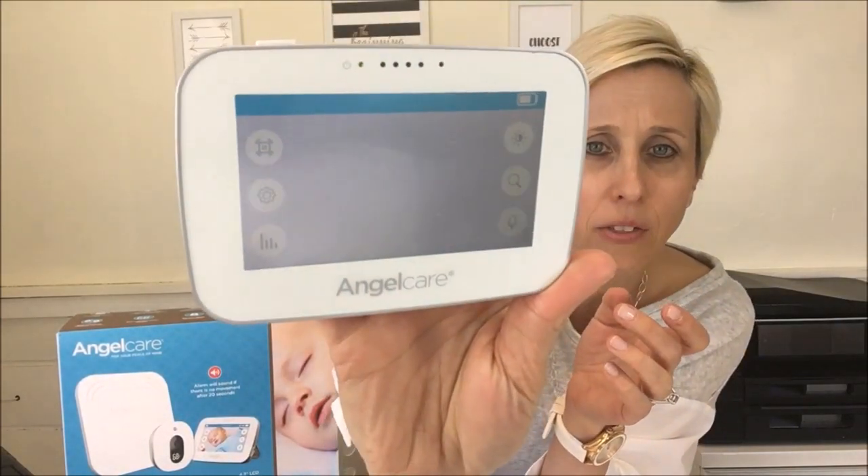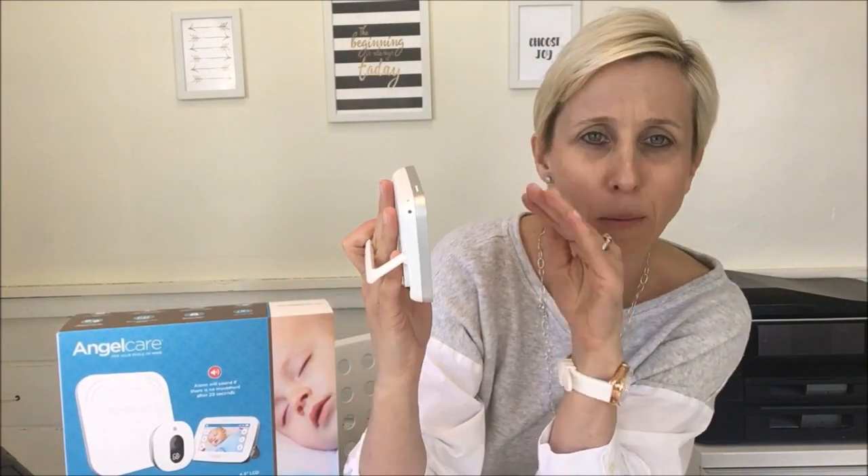Speaking of the sensor pad, you can actually adjust the sensitivity on it, which is a nice feature. When a baby is a newborn, you'll want it at the highest sensitivity. You do it right from the touch screen — there's a little icon on the top right that looks like the pad with vibration lines. As baby gets older, you're absolutely able to adjust that sensitivity down.